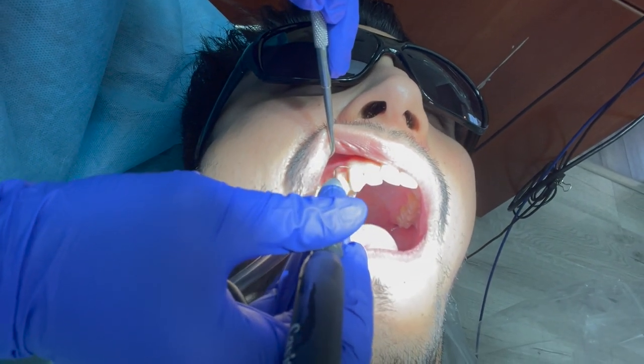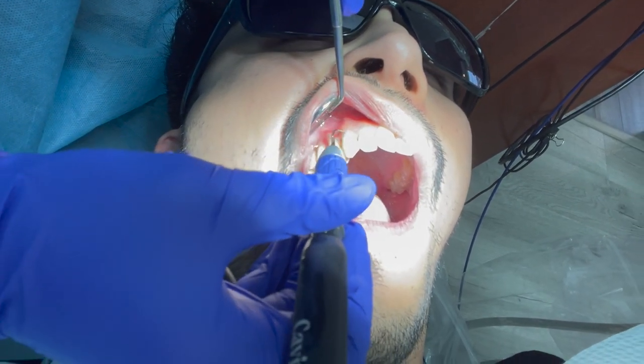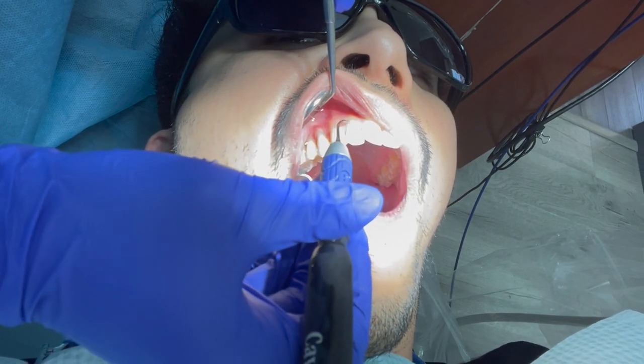I am going to let you guys hear what the cavitron sounds like — what I have to listen to throughout the whole day during all of the cleanings that I do. We usually have some music playing, or our patients just bring their own headphones so they don't have to listen to this as well.